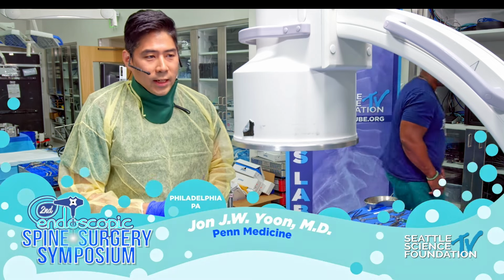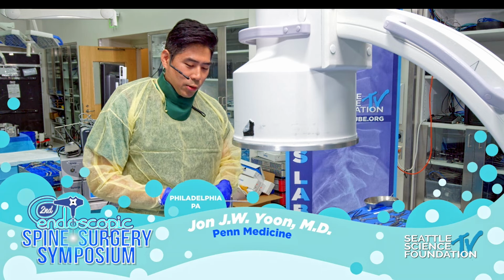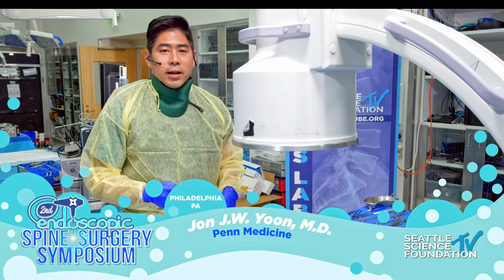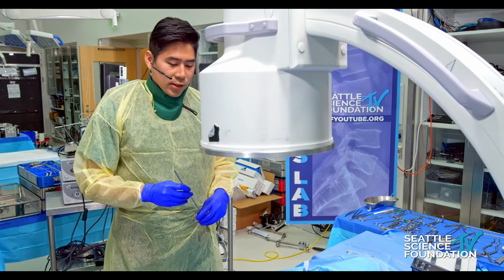So the biportal, I think the targeting will be very straightforward. Let's take a shot here. We have probably a 4-5 still, right? Still intact? Okay. Let's try to do 4-5. So it started with the same thing.